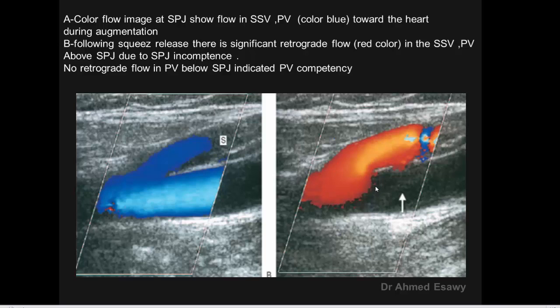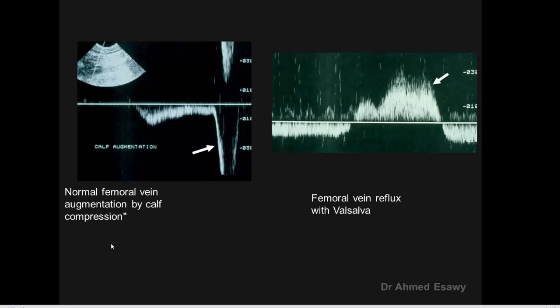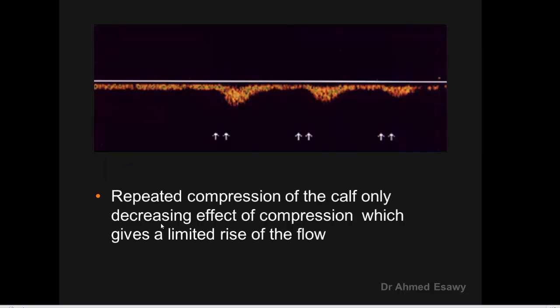A rapid important augmentation of venous flow can be caused by short vigorous compression of the calf, implying normal patency. This is normal femoral vein augmentation by calf compression. An important tip: do not repeat augmentation — do not repeat compression — because repeated compression decreases the effect, giving only a limited rise of flow.